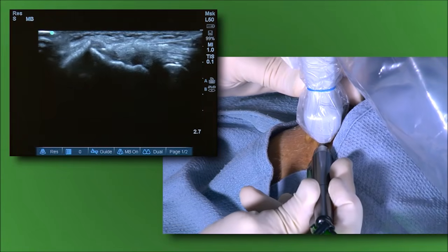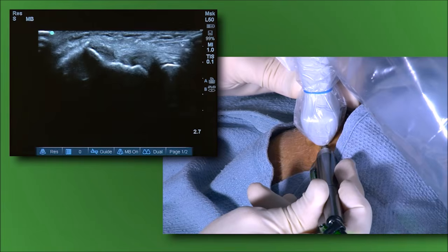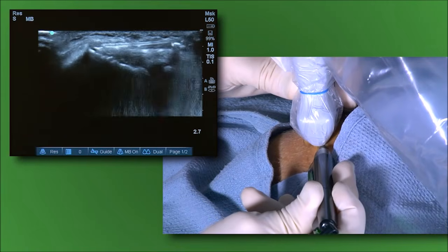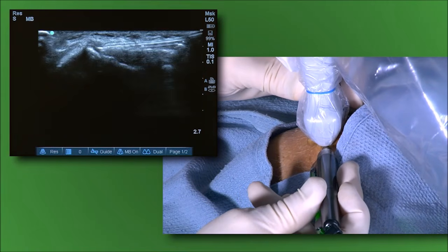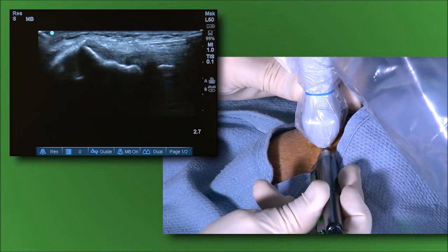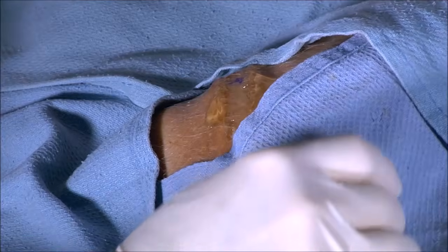And this is right precisely the area and the goal of treatment. I'm penetrating the surface of the bone to stimulate some healing response, as you see on the ultrasound, and that really would conclude the treatment here. Does this cause any problem? No? Good. Okay, so with that, we'll withdraw the microtip.